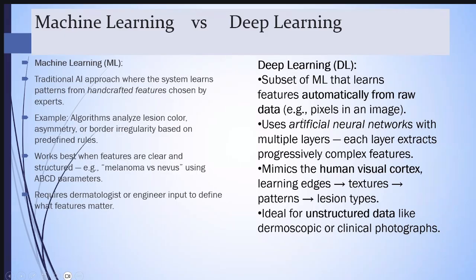And deep learning, as I told you, you're going to study in pixels, which obviously we can't be doing as human beings. And you study it at multiple layers, and all the complex features are taken. Sometimes certain features which we as clinicians wouldn't have picked up can be picked up by this deep learning process. So this is going to mimic the visual cortex.